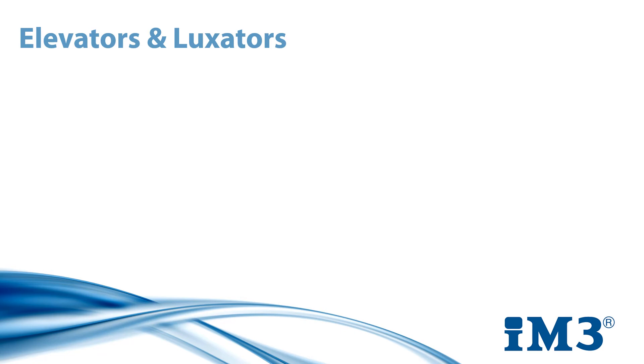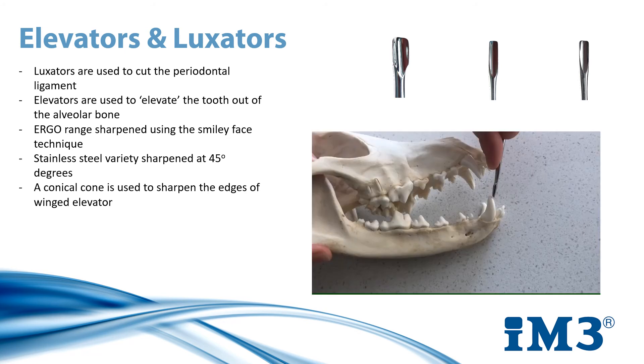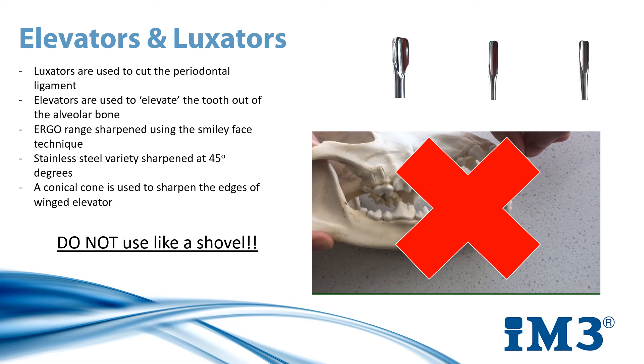Next on our list of hand instruments are elevators and luxators, both of which play their own very important part in tooth extraction. Luxators are used to cut the periodontal ligament, and therefore are always used before an elevator. Elevators are used after the periodontal ligament has been successfully cut to elevate the tooth out of the alveolar bone. They come in two forms, usually winged elevators or straight elevators. IMT3's ergo range of elevators and luxators should be sharpened using the smiley face technique, while the stainless steel variety are sharpened at 45 degrees. When working with winged elevators, the edges also need to be sharpened and this is done with a conical stone. One important thing to note is that elevators should not be used like a shovel, as this applies tremendous pressure on both the jaw and the tooth and can damage the tooth and also the surrounding structures.